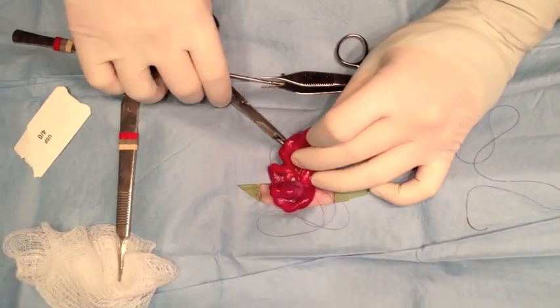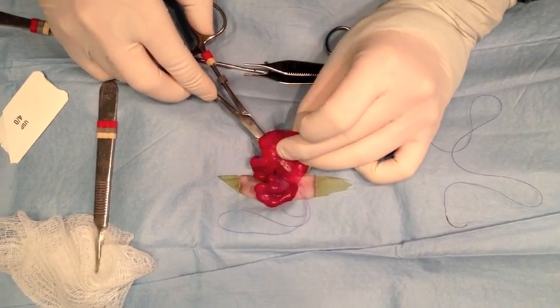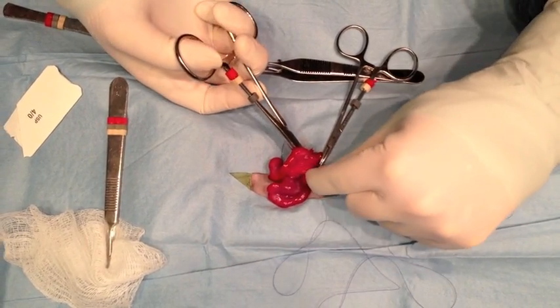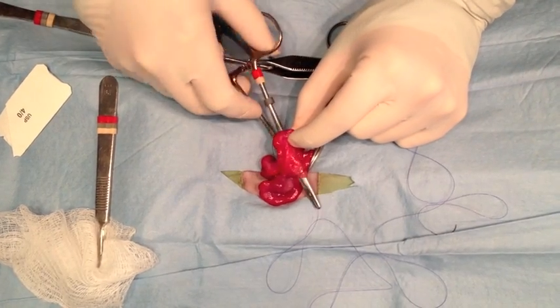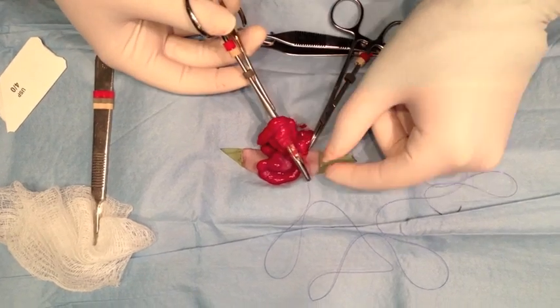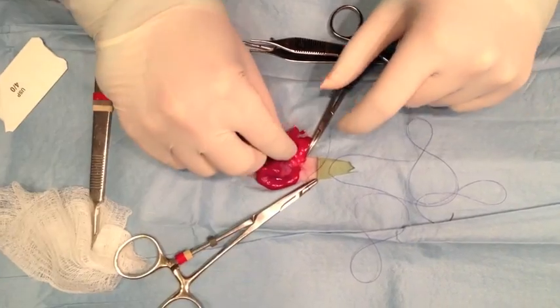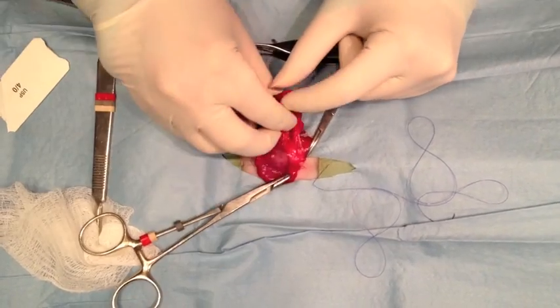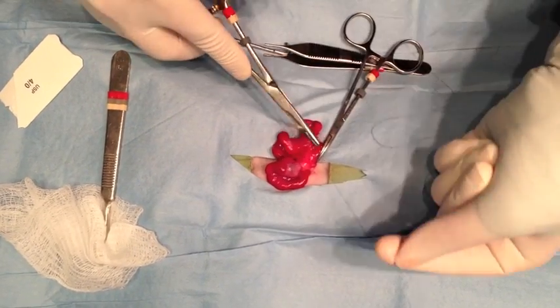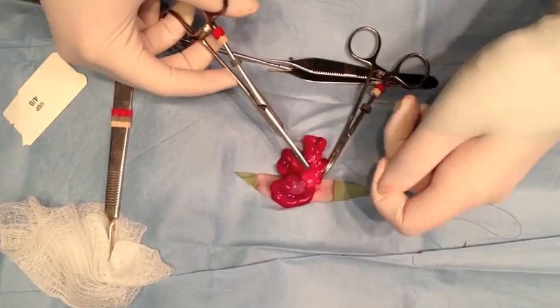In a really fat bunny you're not going to be able to see those vessels — you'll just have to blindly ligate. In a really thin or young rabbit you can easily see those vessels. The downside of doing a young rabbit is that everything pulls apart really easily, so you can barely pull on the uterus and you have chunks of uterus coming out without being attached to anything. Here I've made a window on each side of the vessels and I'm just going to put one ligature around them and then cut that off.